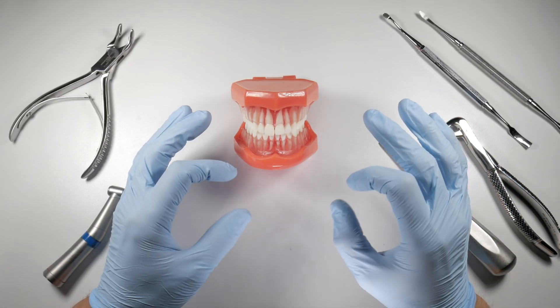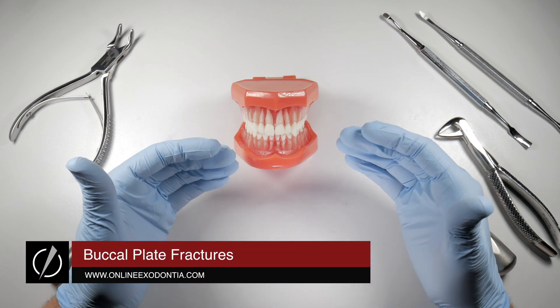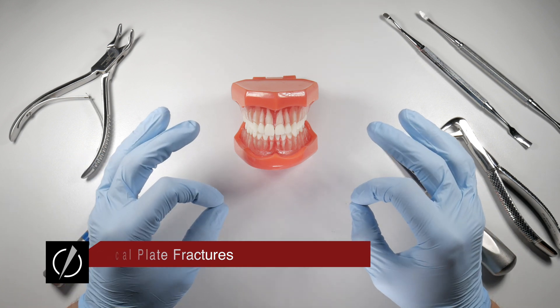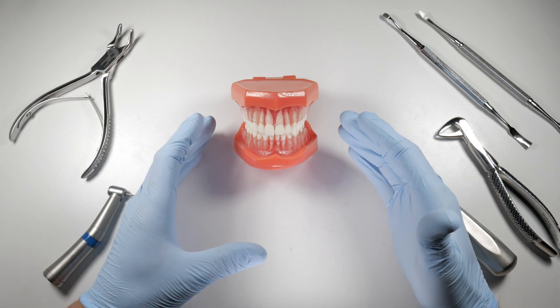If you do enough extractions, I guarantee you will break some buccal plates. This is nothing to lose sleep over, but it's something we want to try to minimize if at all possible. This video is going to show you some ways to prevent this, some of the causes, and the way we want to manage it should it occur.